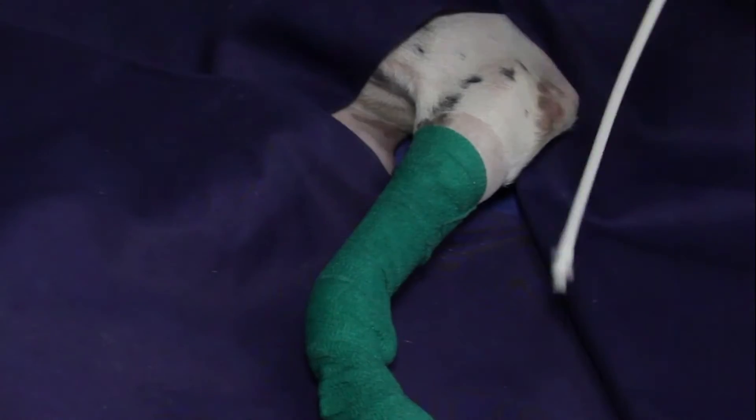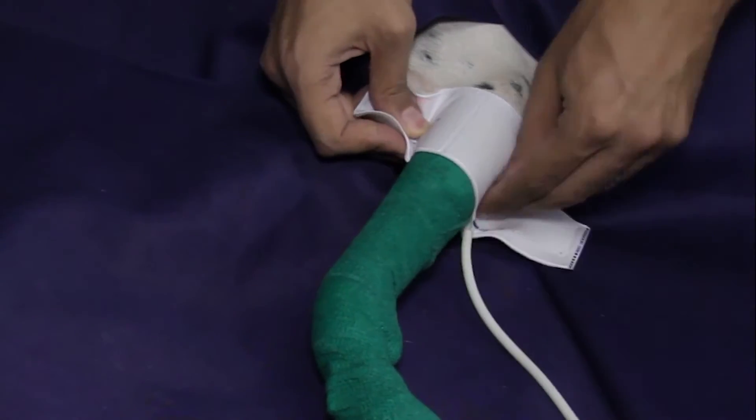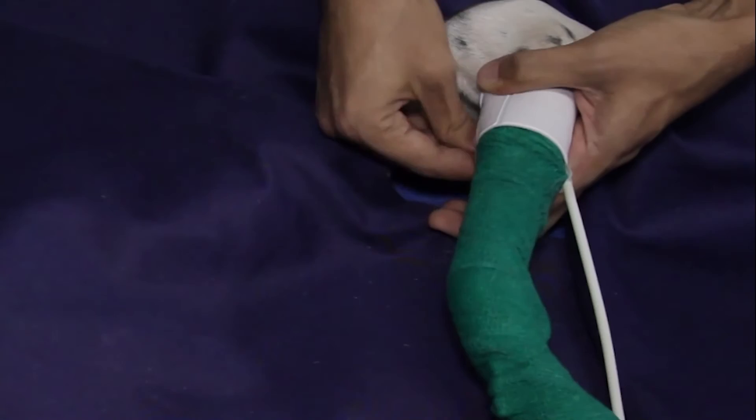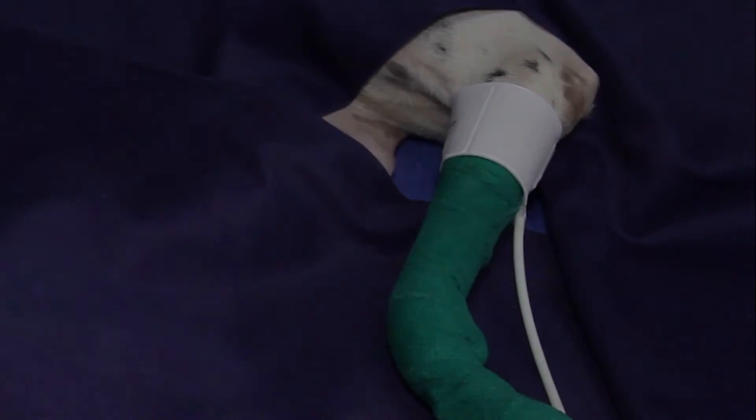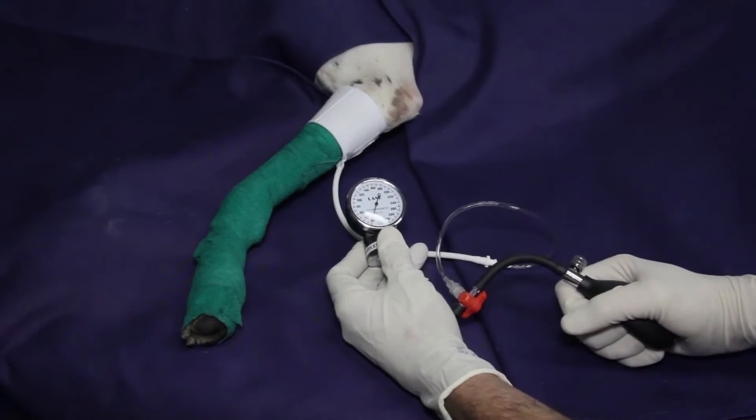A pneumatic tourniquet is applied to the proximal limb. This will allow for greater control over the amount of pressure applied to the limb, thereby minimizing the risks and discomfort to the animal.